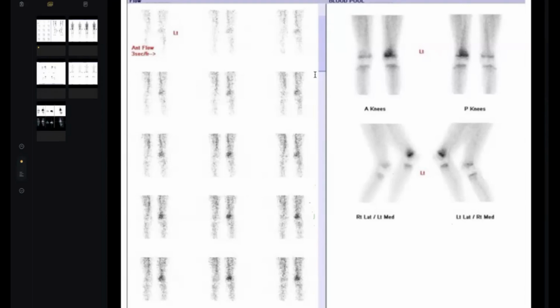One second. There are three questions. In this session I will answer the questions because nuclear medicine is very confusing for all of us. One question: this is osteoblastic metastasis, then why are there no super scan? Because the patient is lucky. This is the answer. Doctor, thank you for this question.